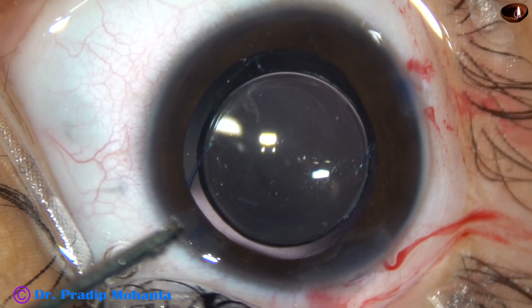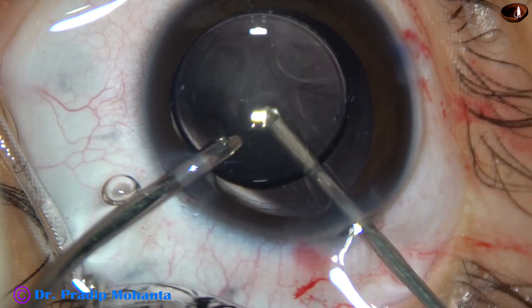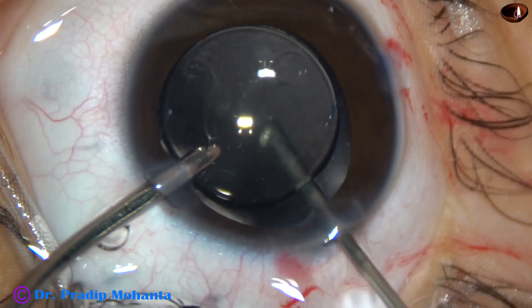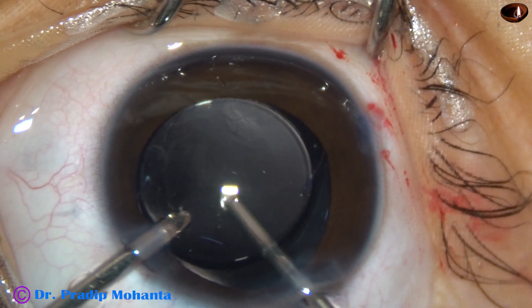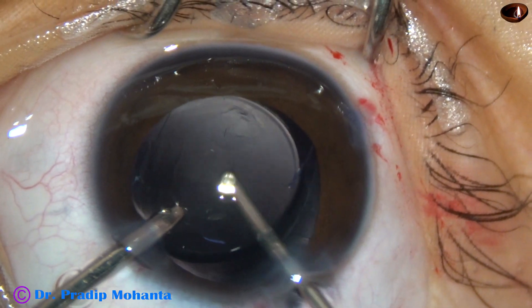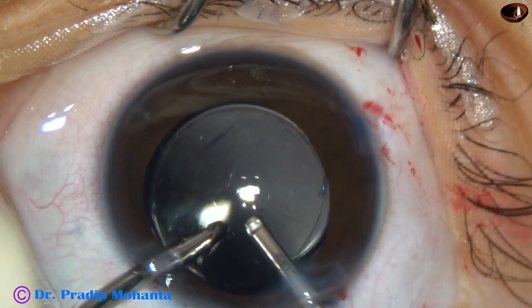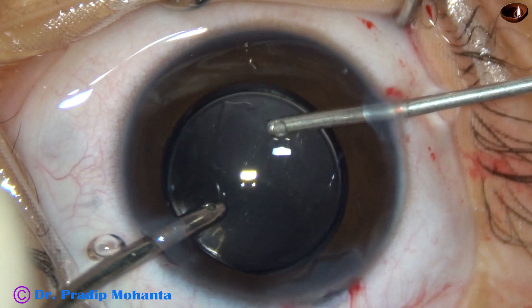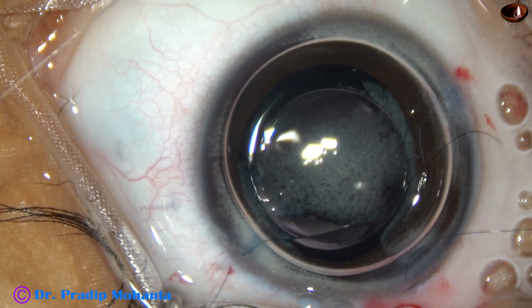Now the lens is nicely centered in the capsular bag. After removing the viscoelastic from the anterior chamber, I have gone behind the IOL and am removing some anterior vitreous. This is very much necessary because if the anterior vitreous face is intact, the anterior vitreous will act as a scaffold and a lot of cells will grow over the anterior vitreous face. So a space is created so that no cell can grow behind the central part of the optic. We know that in pediatric cataracts, posterior capsular opacification occurs even within two weeks.